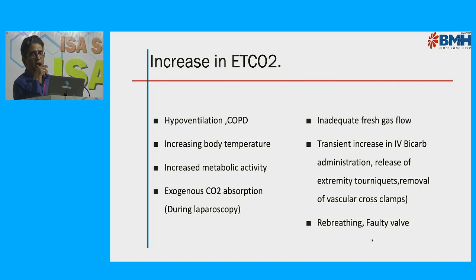So can someone say about the conditions which increase the EtCO2? There are conditions which cause an increase in metabolic rate, like hyperthermia, fever, malignant hyperthermia, sepsis. You can classify everything into increased metabolic activity. Seizure, shivering, then hyperthyroidism. These are the states which increase the metabolic rate.